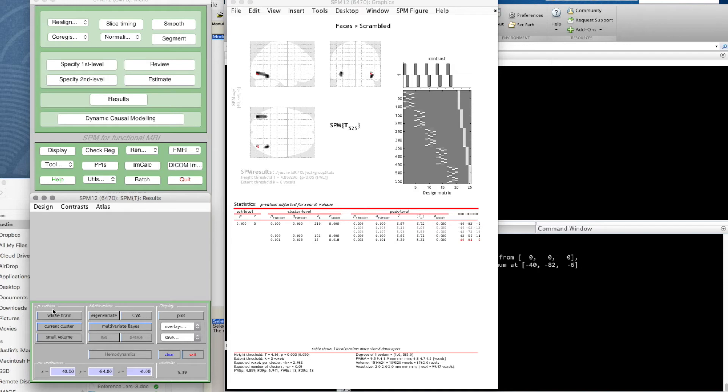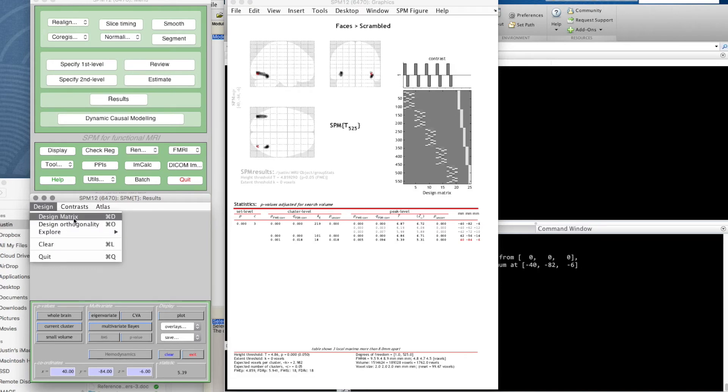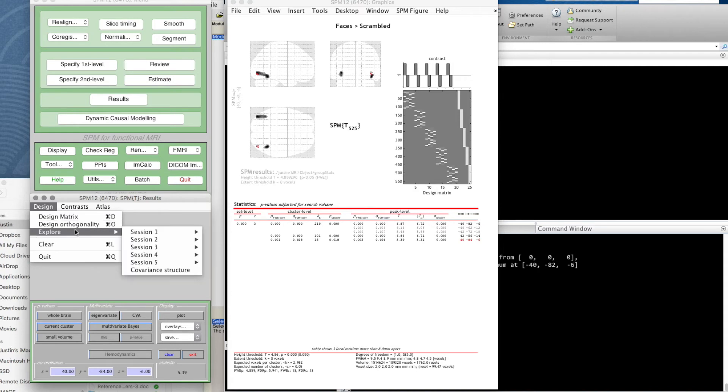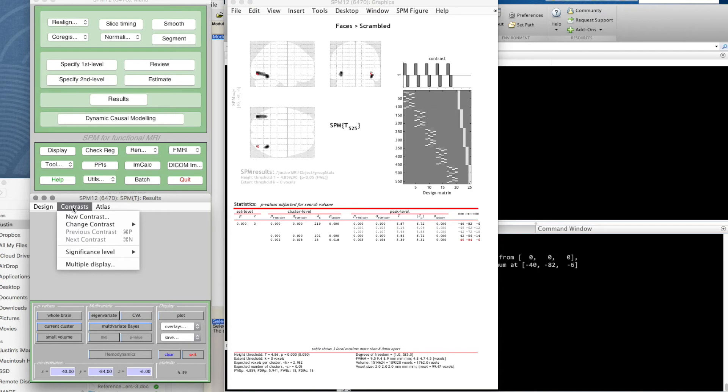That's just this quick summary. In the figure window, in this panel, we've got all kinds of things as well about coordinates, the current statistic, p-value panels, multivariate panel, and a display panel, and some menus. The design menu we've already seen.